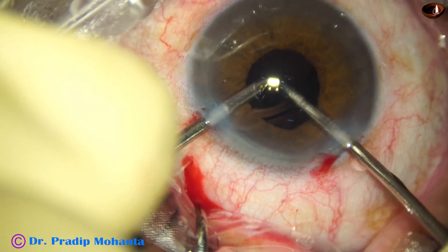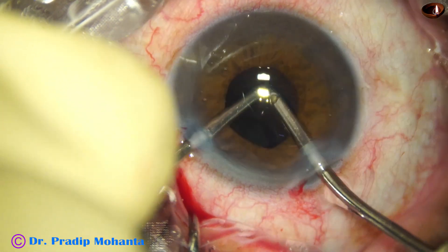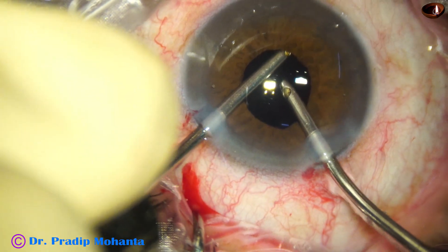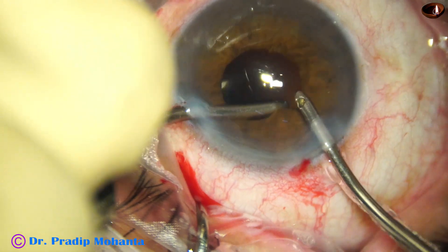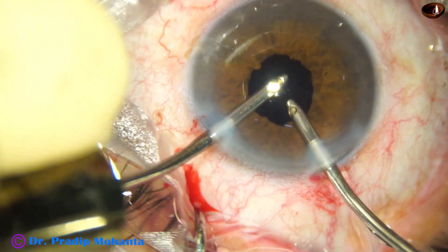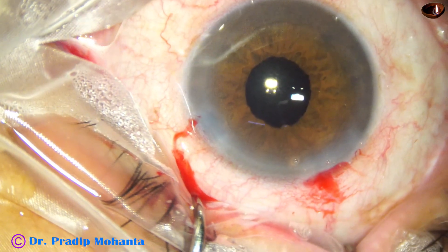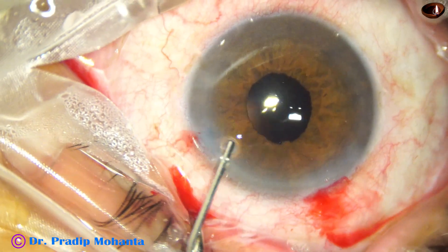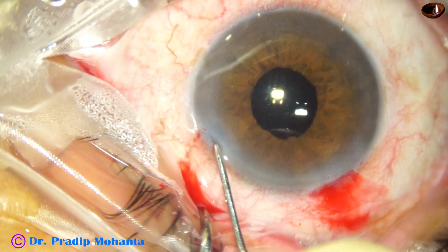The irrigation goes behind the lens; aspiration is above the lens, irrigating and aspirating for some time. Now I am holding the pupillary margin and pulling it posteriorly and centrally because this patient has an angle closure component. The anterior chamber was very shallow and there are some changes in the optic nerve head.